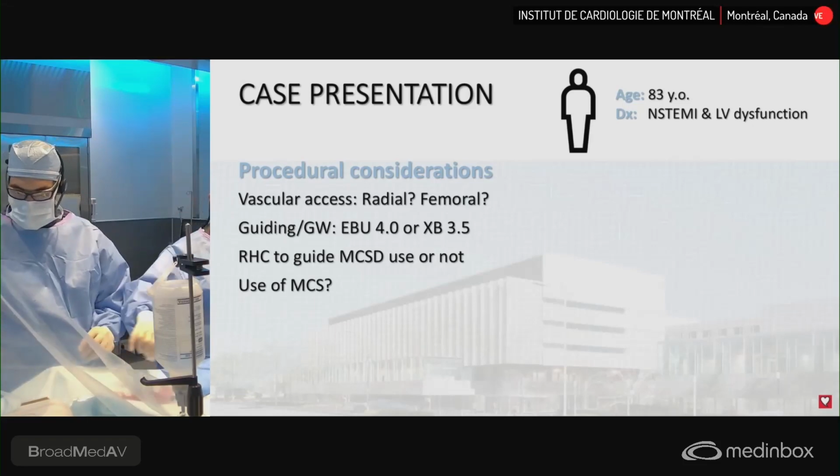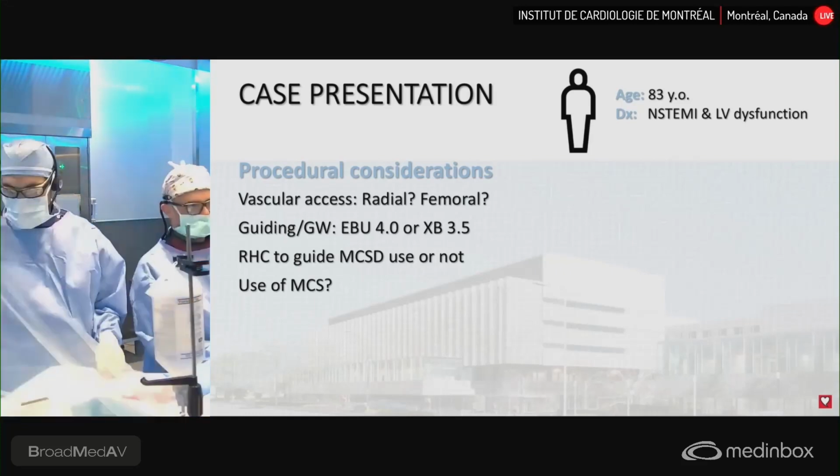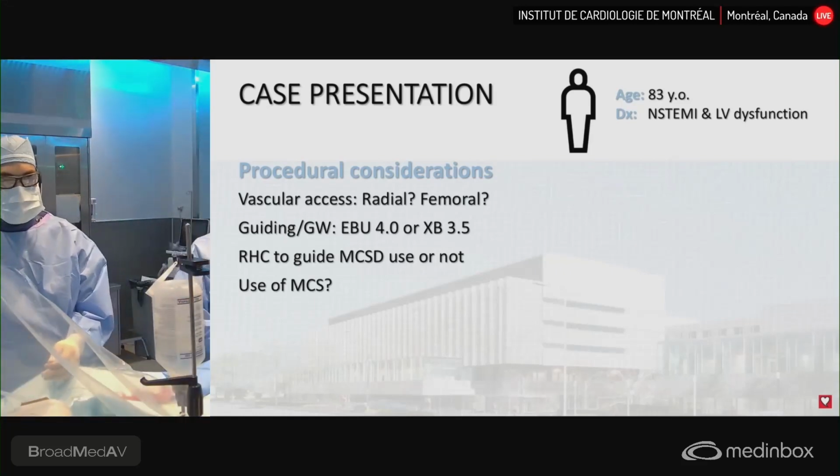Radial approach, we did not think of using mechanical support because the patient was stable and we had revascularized the LAD.